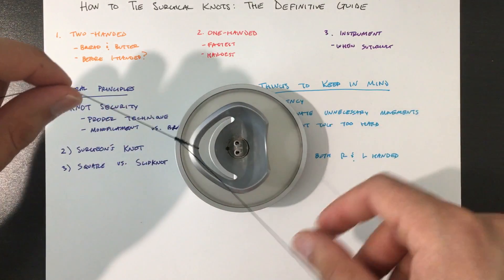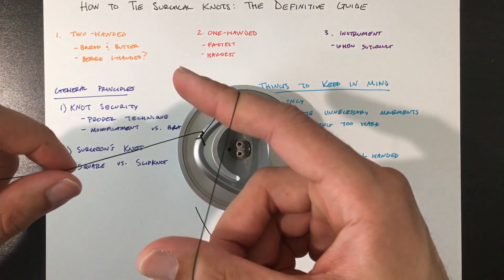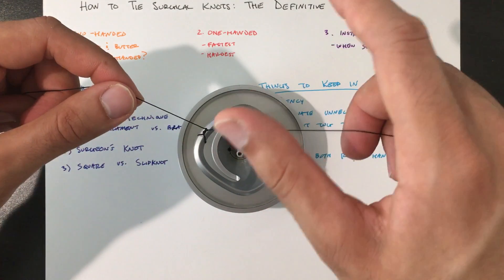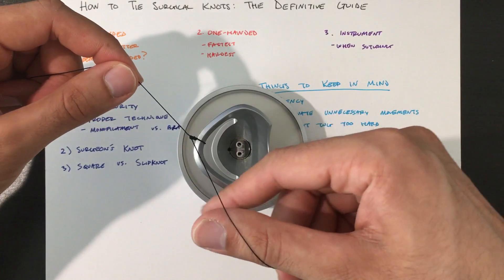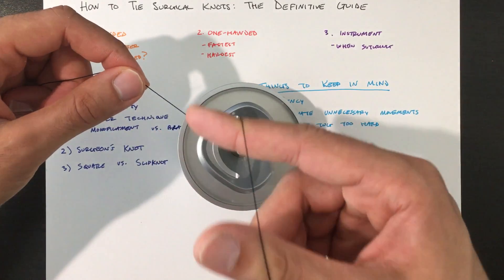So once you do the book, now you do the gun. So to do the gun, wrap it around your thumb first, then your index finger like this.